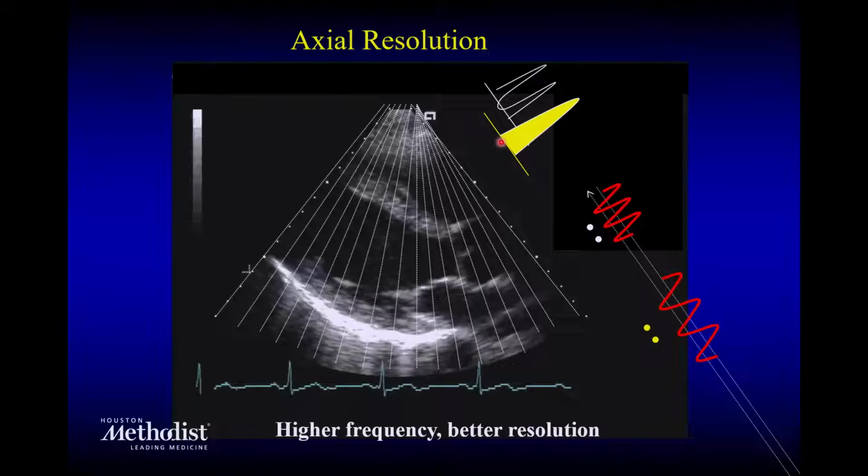A couple of points regarding resolution. This is pertaining to echocardiography per se. There is axial resolution and lateral resolution, and maybe in 3D a resolution between the various planes, which is azimuthal resolution. Now we talked a little bit about that the resolution is also dependent on frequency.